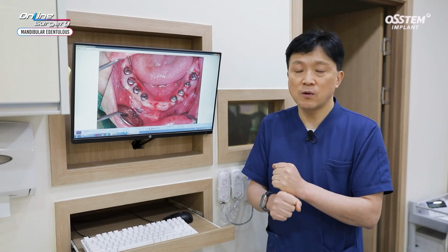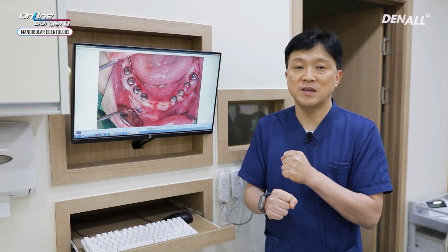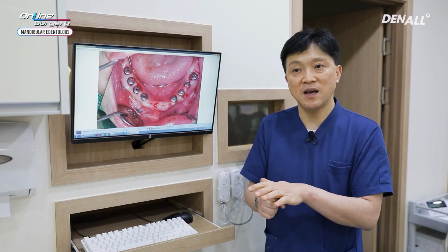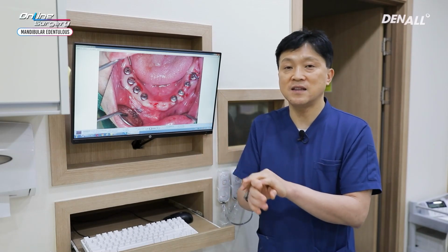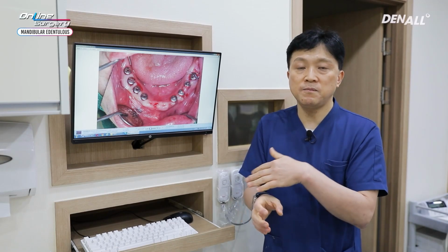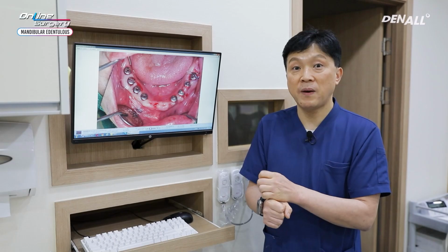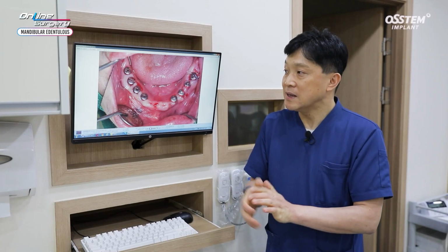Therefore, in order to reduce the amount of bone removed, you need to use initial drill to remove the bone in the center point first and then use a flattening drill. In other words, you don't use initial drill full depth because it can't go in because of the barrels. You need to remove the surrounding bone using flattening drill. If you do this, you may be able to remove the surrounding bone using flattening drill more easily.